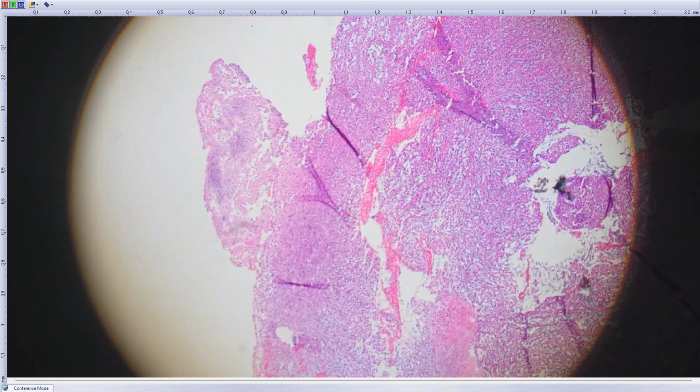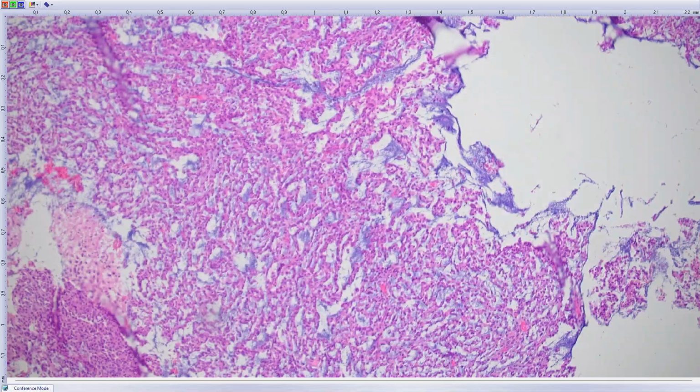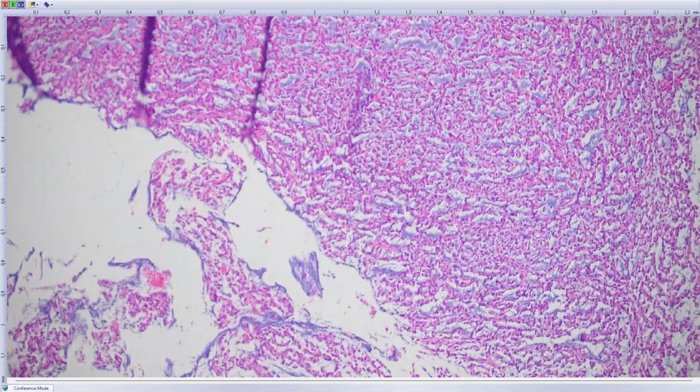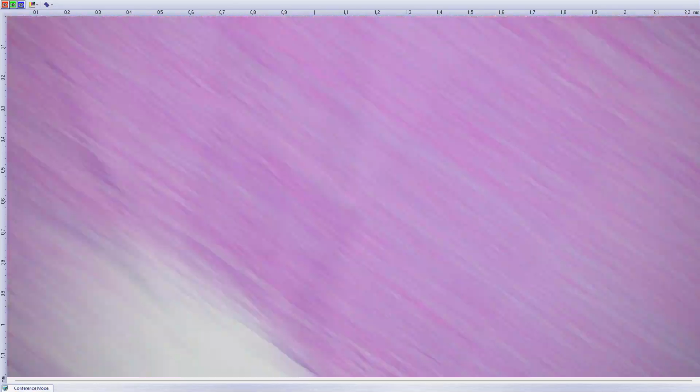So this is just a diagnosis based on immunohistochemistry and compatible morphology, but there are no morphological clues basically for this diagnosis because there are no adipocytes. There was no information that there is a retroperitoneal tumor or anything. So just don't forget the MDM2 in the immunohistochemical panel. There is a nice paper by Abazagami about dedifferentiated liposarcomas with epithelioid and rhabdoid features. Yes, this was kind of epithelioid, pleomorphic.